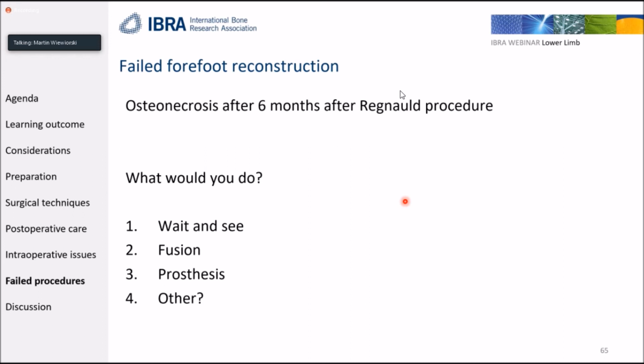Basically, you just take a piece of the iliac crest, which is a tricortical bone with very good stability, and after resection, once you have healthy connection surfaces, you can put this in and fix it nicely, like with one of those revision plates, for example. But you just make sure that you have sufficient compression. And some of those patients after this kind of procedure have to do non-weight bearing, in my opinion, for 6 to 8 weeks. I would even put them maybe in a cast if they are less compliant.